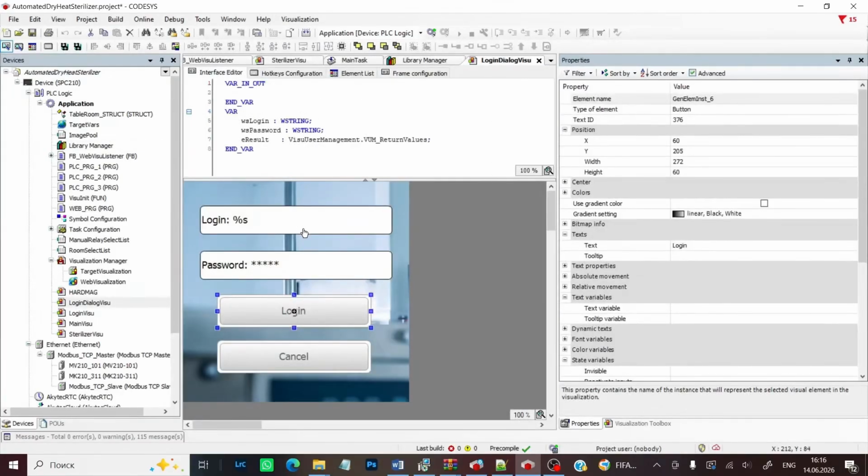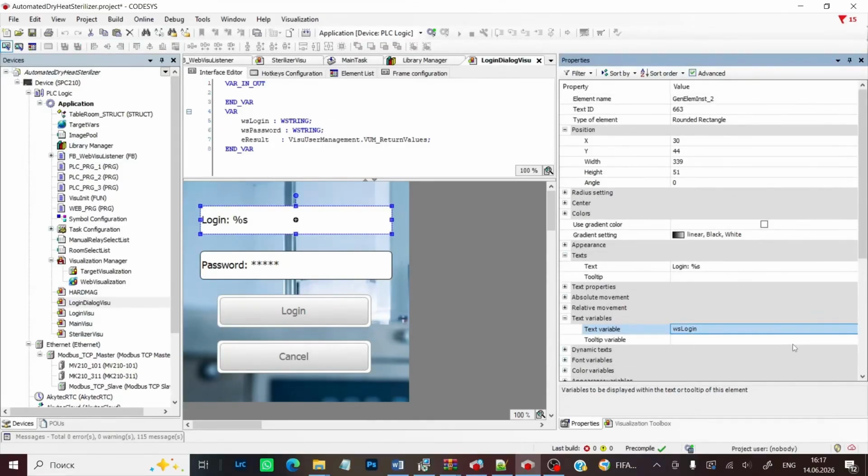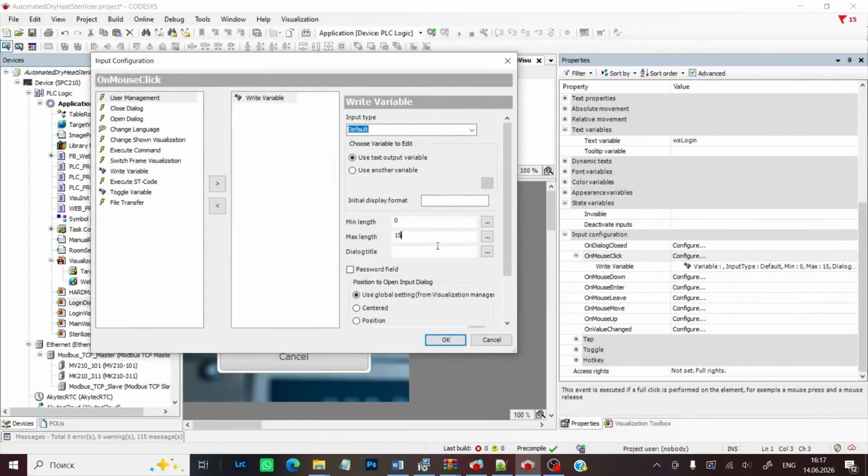To do this, I created another visualization, and I added 2 rectangle elements for the username and password, and I added 2 buttons for user registration and exiting the dialog window. In the interface editor, I added the necessary variables for user authorization. In the first component for entering the name, I linked the appropriate variable from the interface editor to the text variable field. And for entering a new value, I specified the minimum and maximum number of characters for the username.